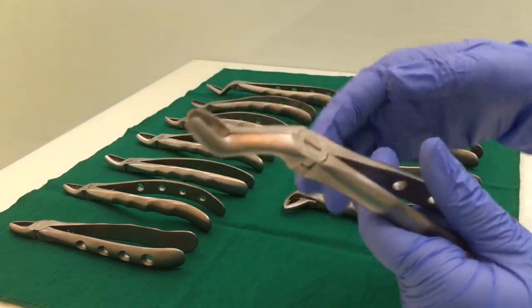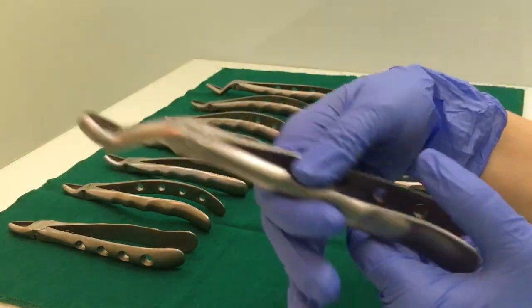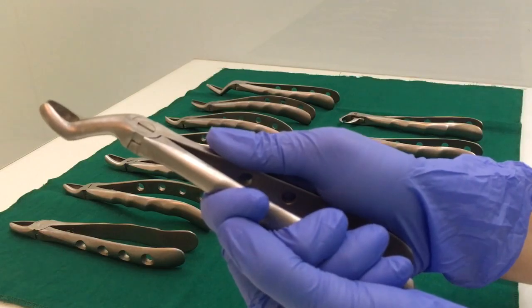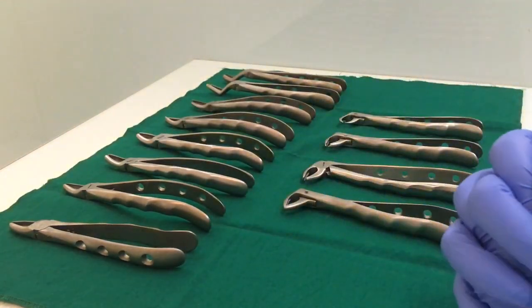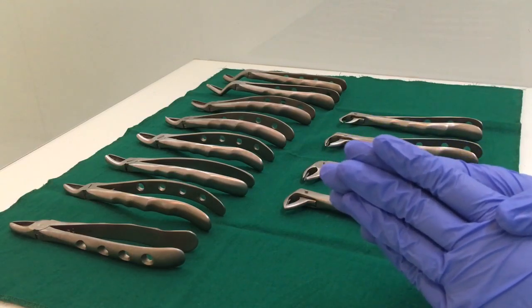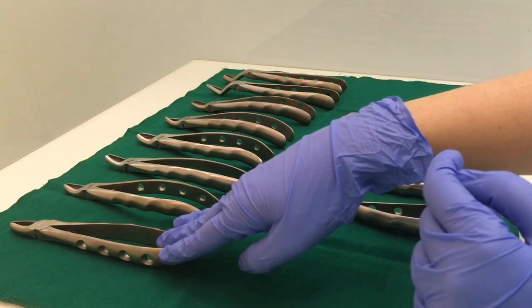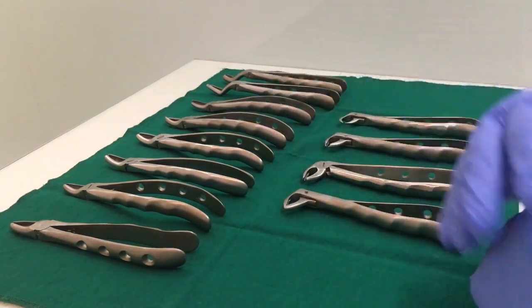You can see the difference between the upper root and the upper third molar. The upper third molar forcep has no side — whether right or left, you just hold it and use it. So we have learned about all the upper forceps: how to identify them mainly on the basis of the beak, and the upper anterior forcep on the basis of the handle, which is flat, unlike the others.